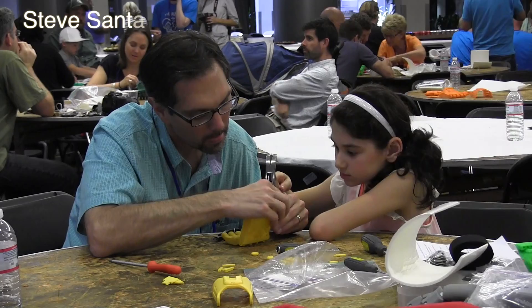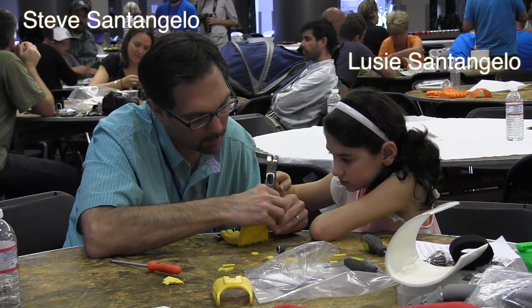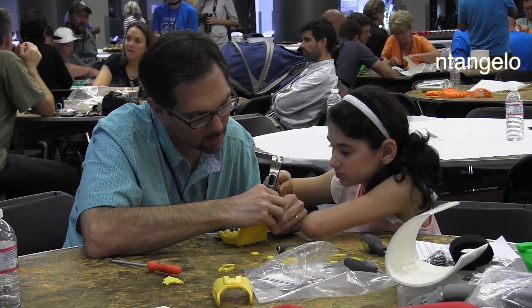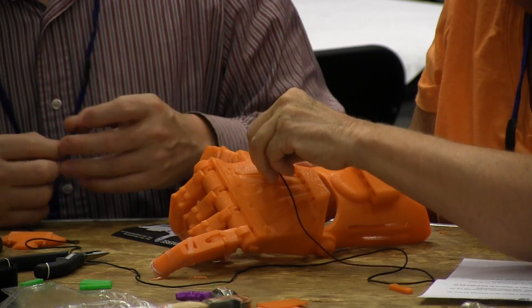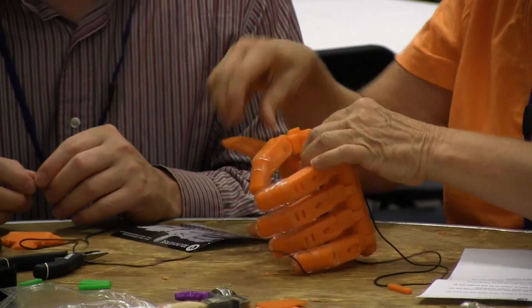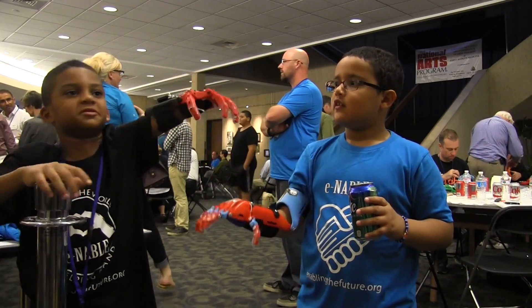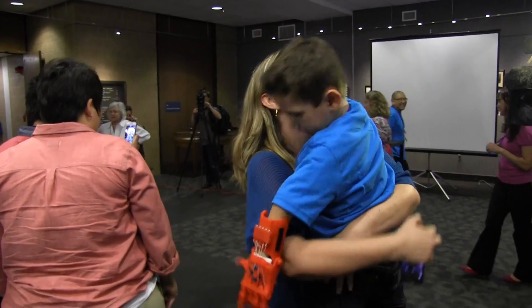There's a lot more that goes into it than you might actually think. We've been working with RIT since July on creating an arm-hand combination for her to use, and when we received the invite we were very excited. We thought it would be a great opportunity to meet other families and children that have differences similar to Lucy's and learn more about the different technologies.